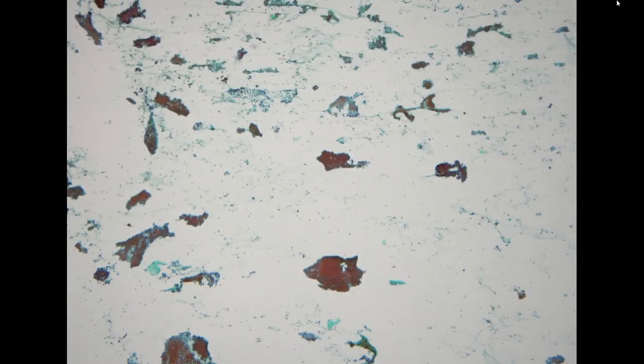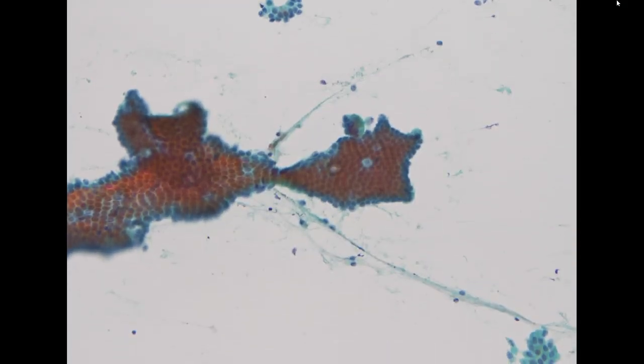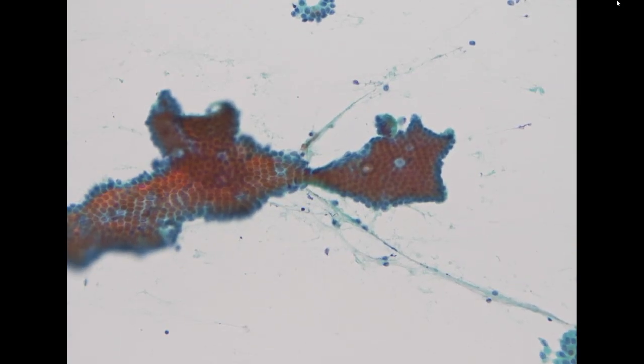Next we have 2 patients with pancreas cancer. This is pancreas EUS cytology. For EUS cytology, it is common to have some intestinal contamination. So this is from the small intestine, from the duodenum.